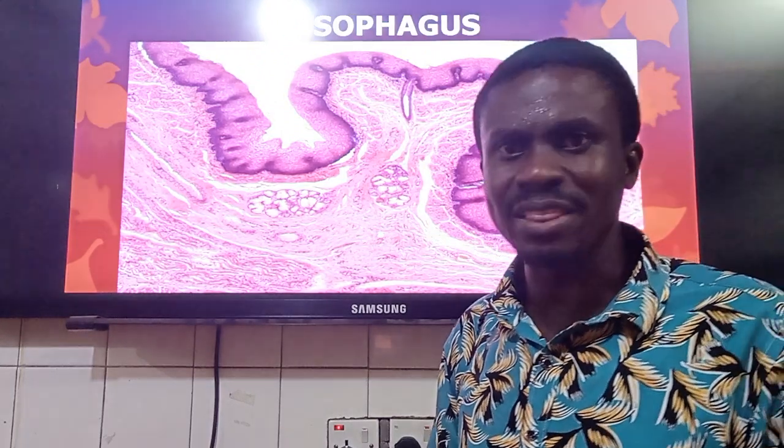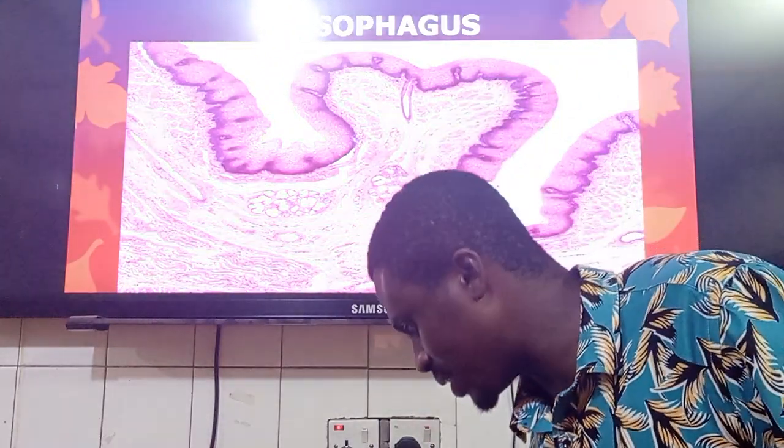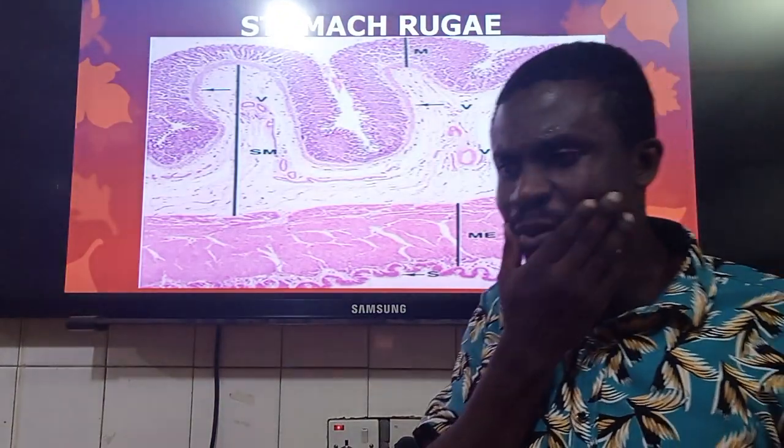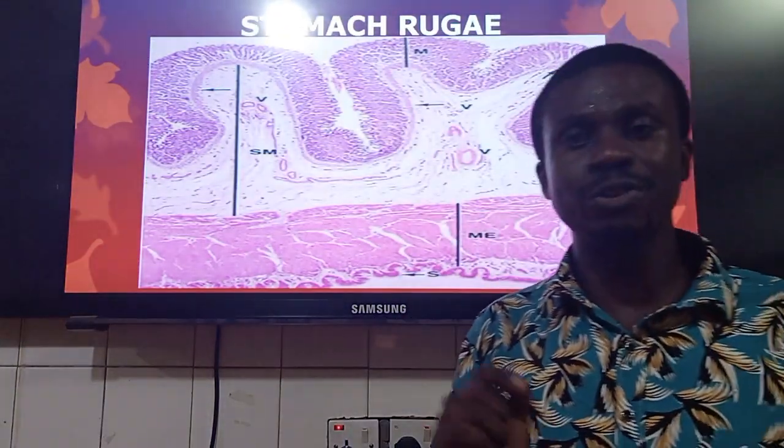Let us see. Okay, these are useful. Tell us about the muscle disposition of all these things. So rapidly, there's another thing about it. If I move out from the esophagus, I go to the stomach.